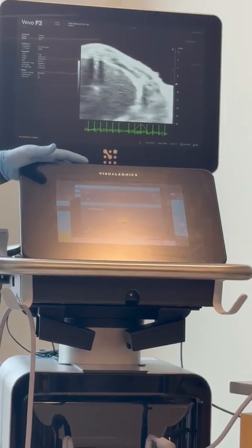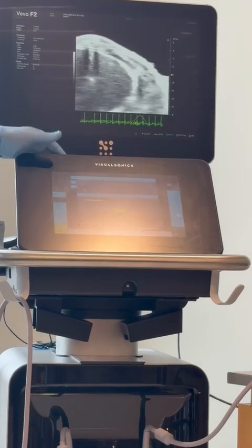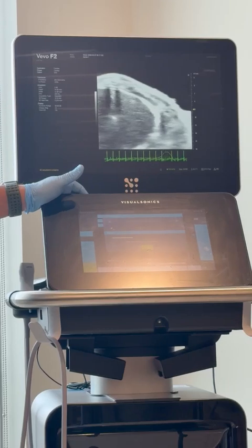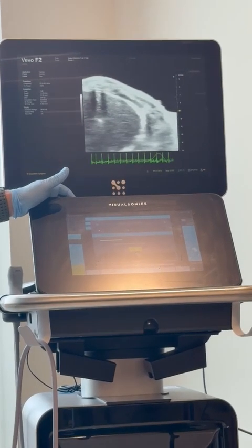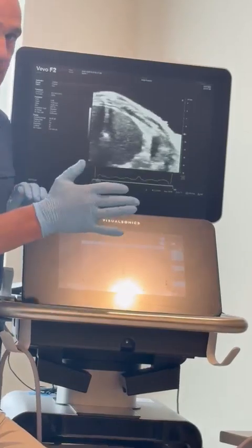So MI, right? When you're wanting to look at your infarct size, being able to look at a 3D beating heart, we can actually measure that infarct, things like that. A little more time consuming with analysis. To do standard, sharp, or smooth, I'm just going to do standard.